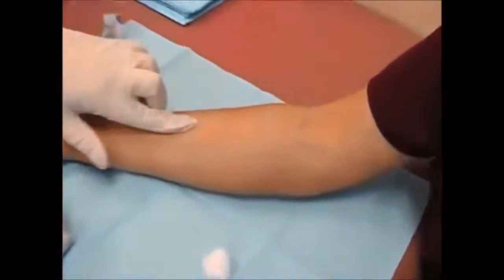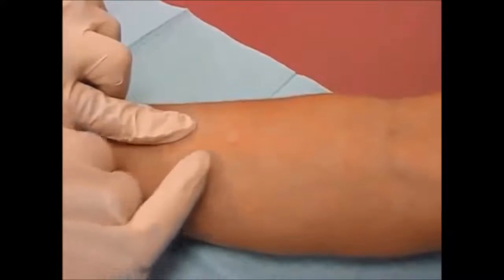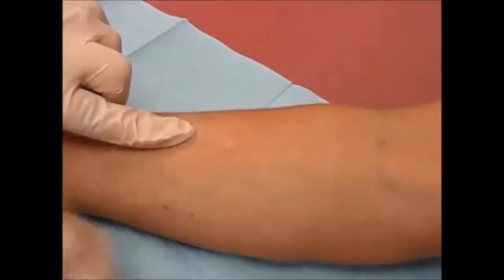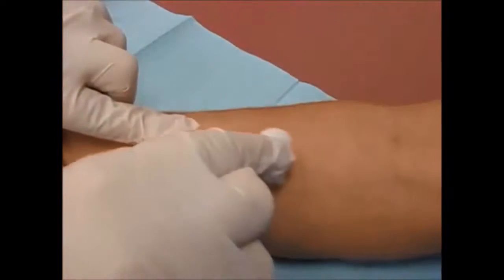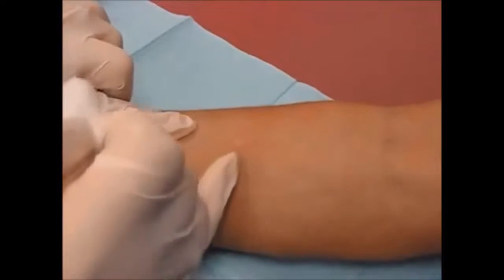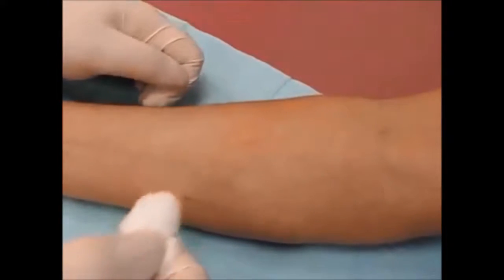Now, Rosie, I noticed that you're not bleeding at all, but it's very common at the actual injection site for a small drop of blood to form. And it's appropriate to take the cotton swab and just, with a feather-like touch, swipe in case there's a drop of blood there. You're not bleeding at all, so I wouldn't have had to do that. But it's very common for there to have been a drop of blood there.